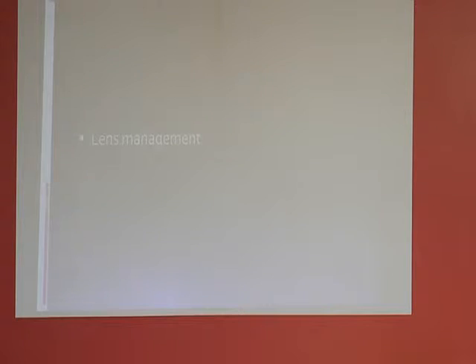Lens management, as Dr. Pukhraj has shown us in a few of the cases, has multiple ways you can tackle a lens. You can do a lensectomy. You can do a lensectomy preserving the anterior capsule. And if you have a small intraocular foreign body, you might do a phacoemulsification.